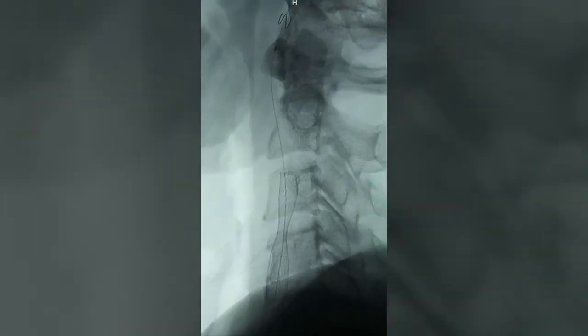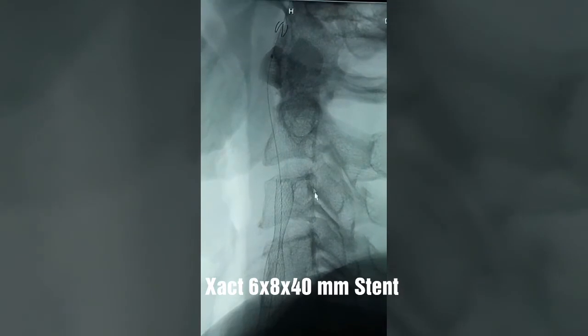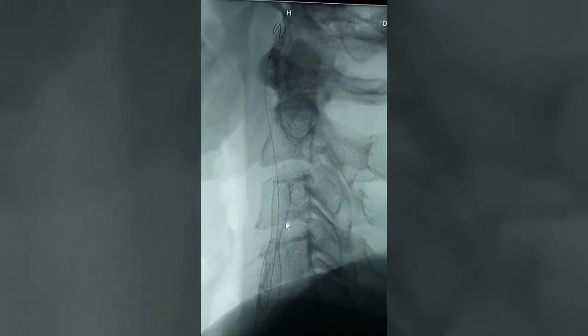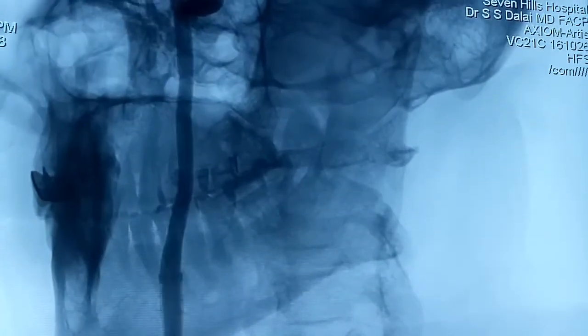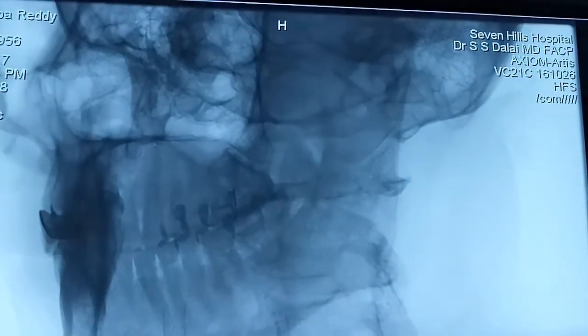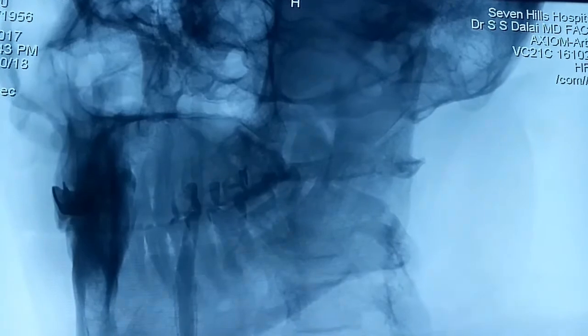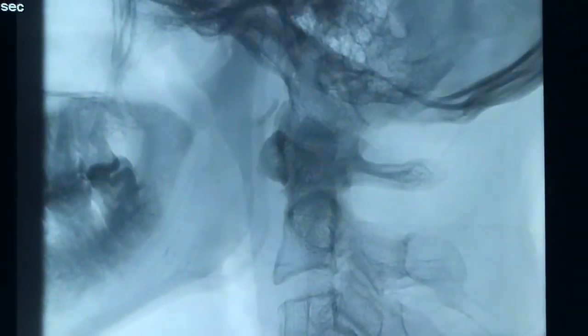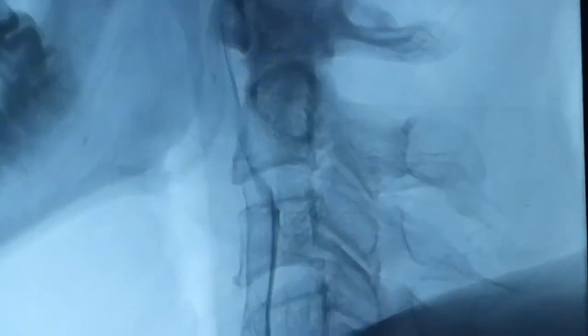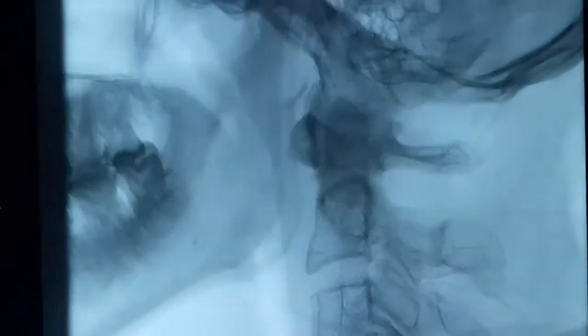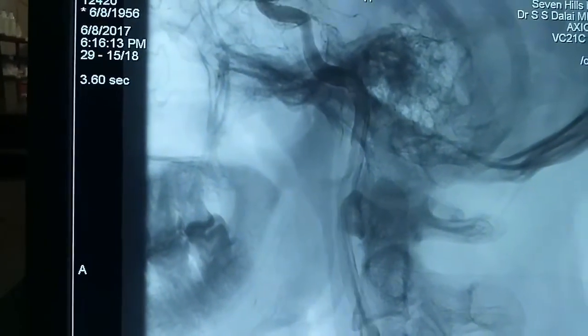We will go with primary stenting; post-angioplasty will be planned if required. This is the stent deployed with very good flow into the cerebral circulation. This is the post-stent picture showing extremely good flow across the stent without any residual lesion, and the flow is going all the way into the brain.